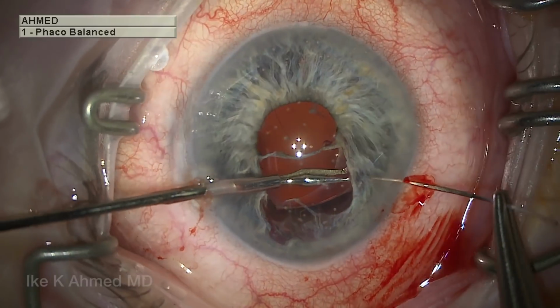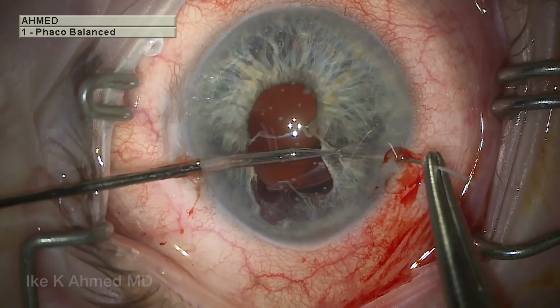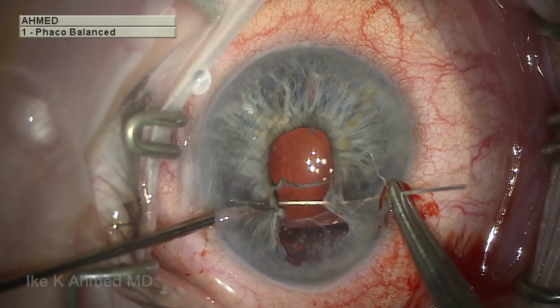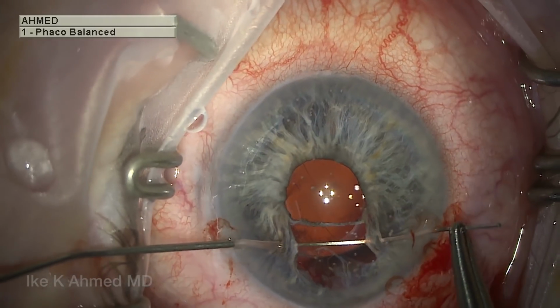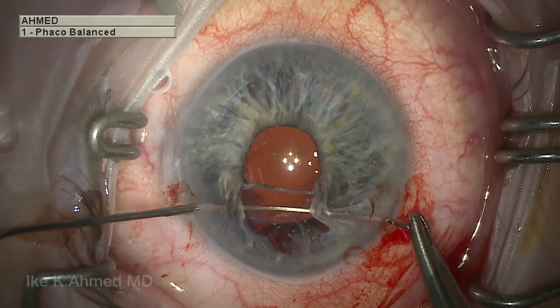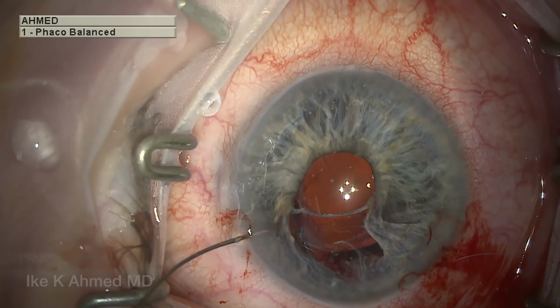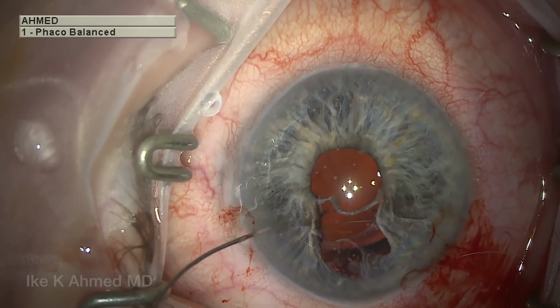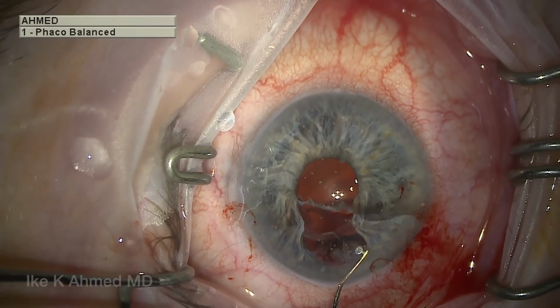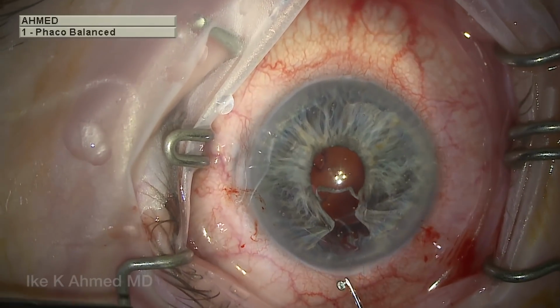Using a polypropylene suture on a long CIF4 needle, this needle is passed through two ends of the iris defect. Notice the strategically placed incisions on the cornea, allowing us to enter and exit the eye with ease using this long CIF4 needle. A docking cannula is used to prevent needle entrapment within the corneal fibers. A variety of suturing techniques can be used, including direct McCannel suturing techniques, as well as Siepser or sliding knots.